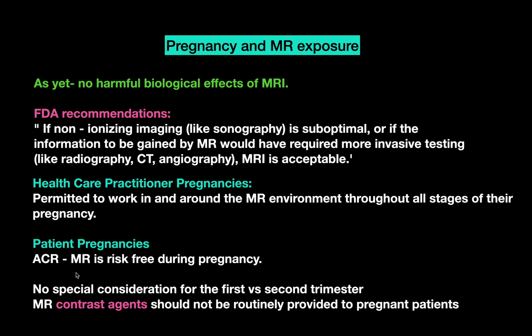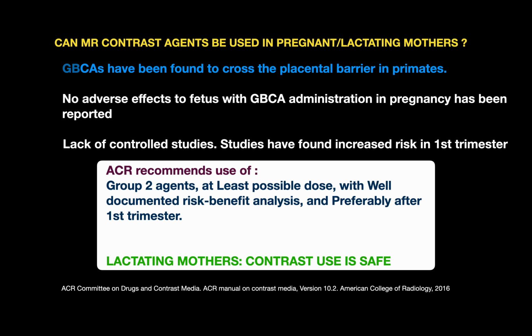The American College of Radiology recommends that MR is risk free during pregnancy, with no special consideration for the first or second trimester. MR contrast agents should not be routinely provided to the pregnant patient. If it's necessary, we can give it.